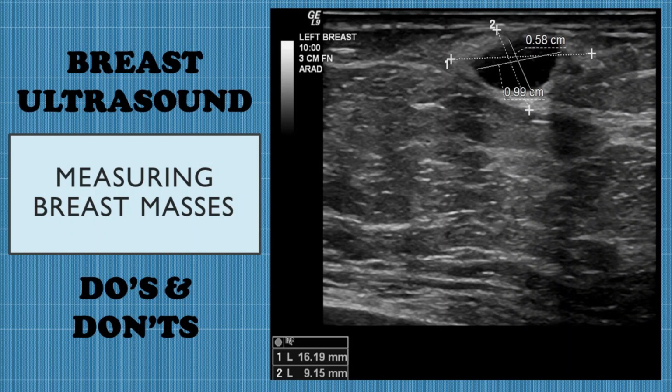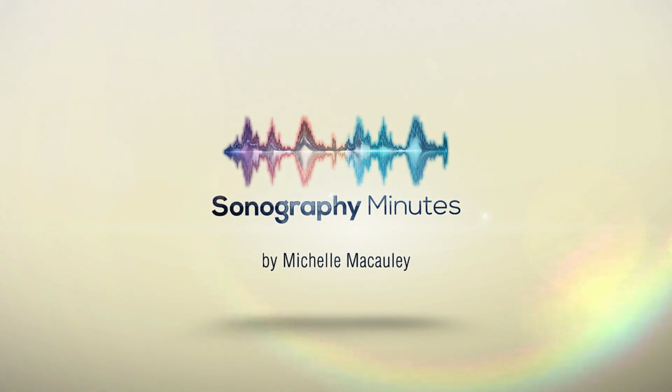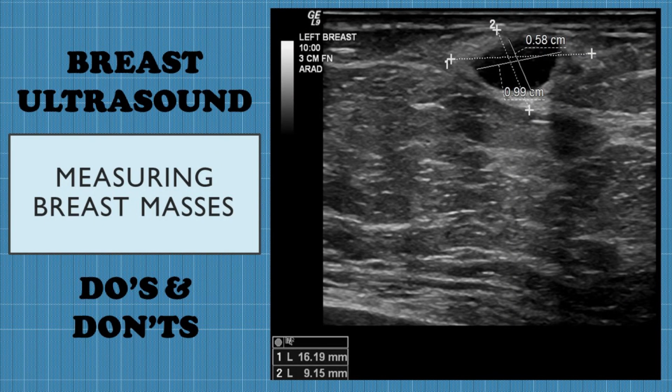Let's measure. Join me for a little breast ultrasound registry review as we explore the proper way to measure a breast mass. So let's discuss the proper way to measure breast ultrasound masses.